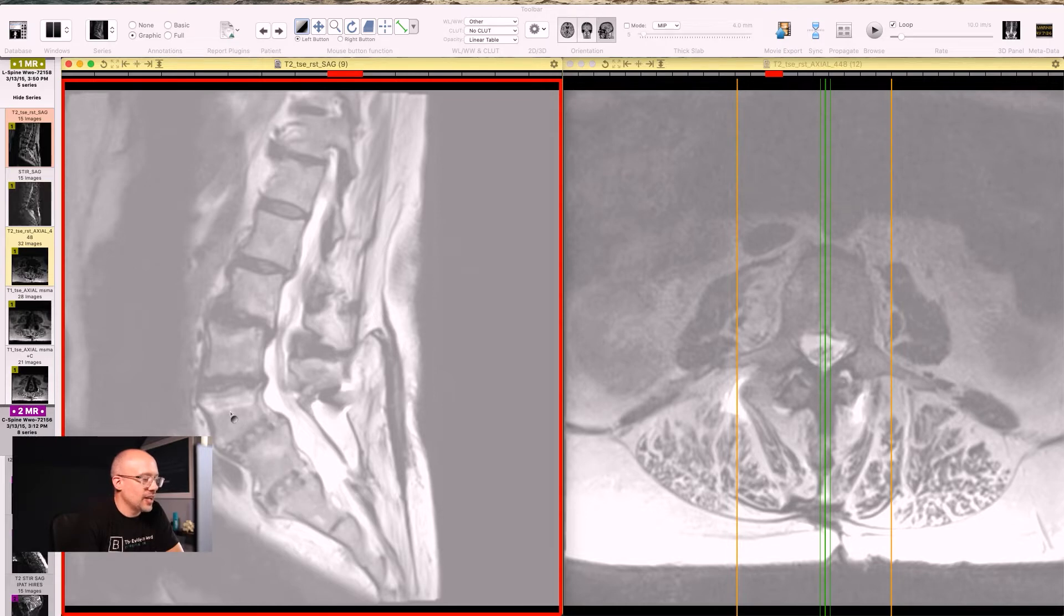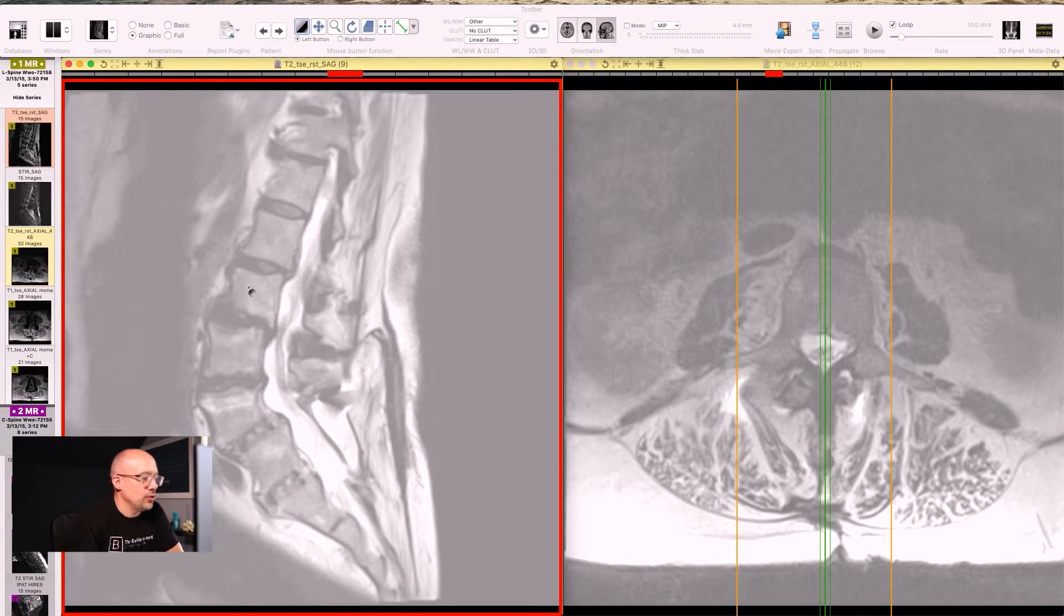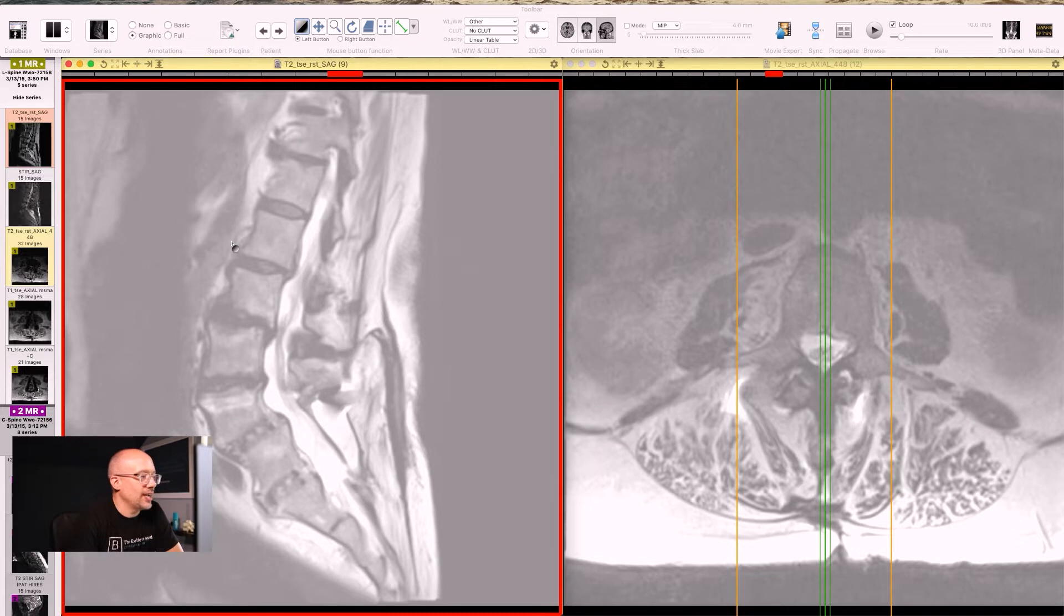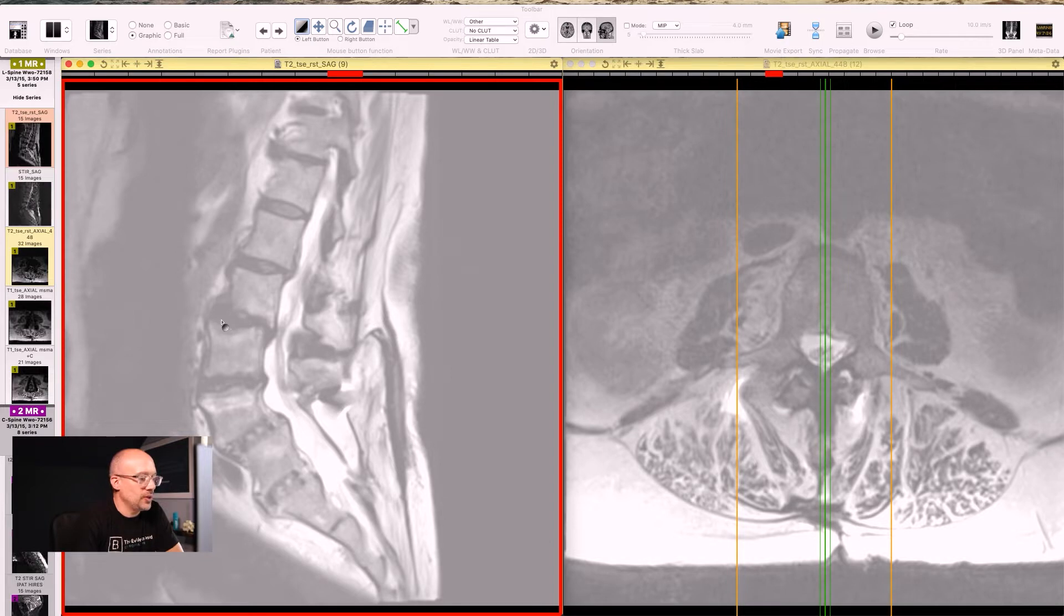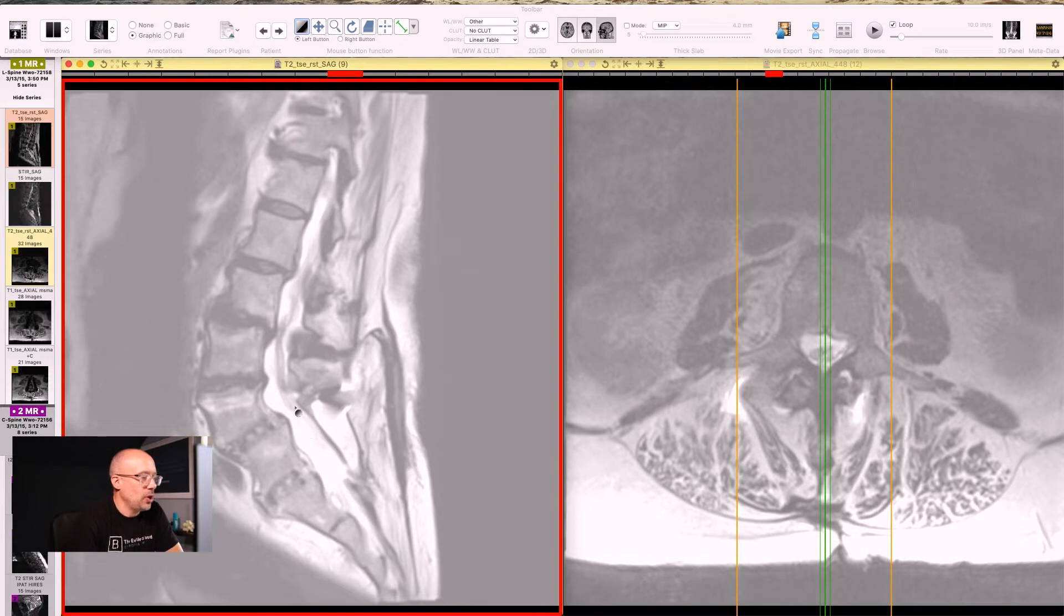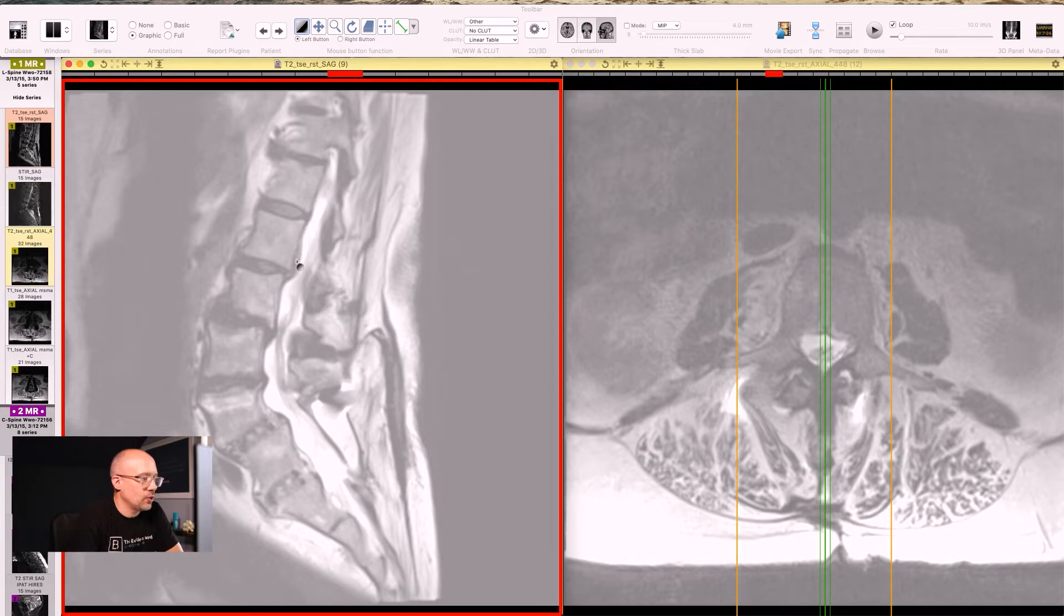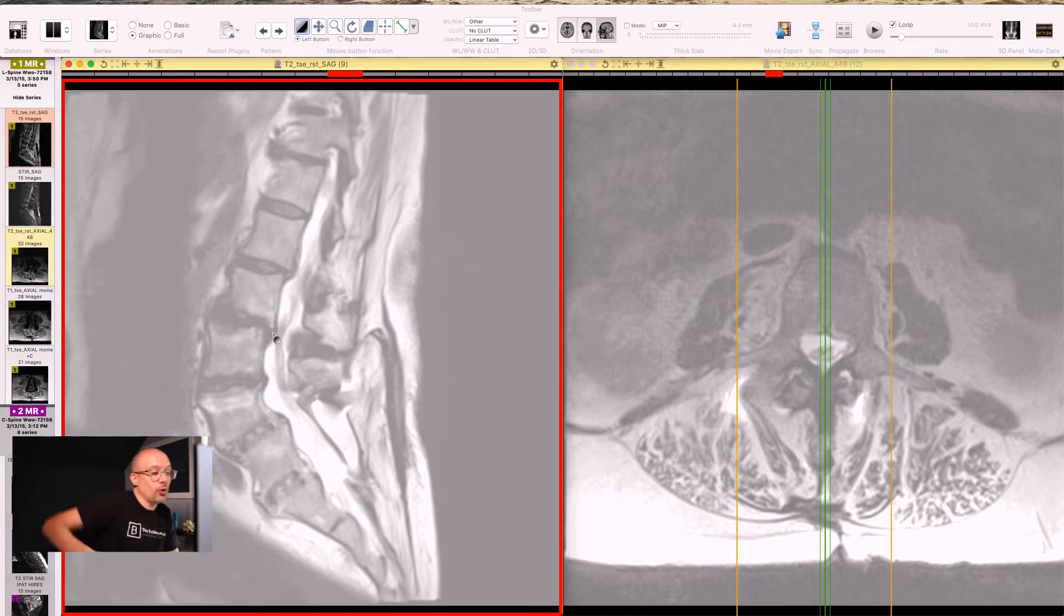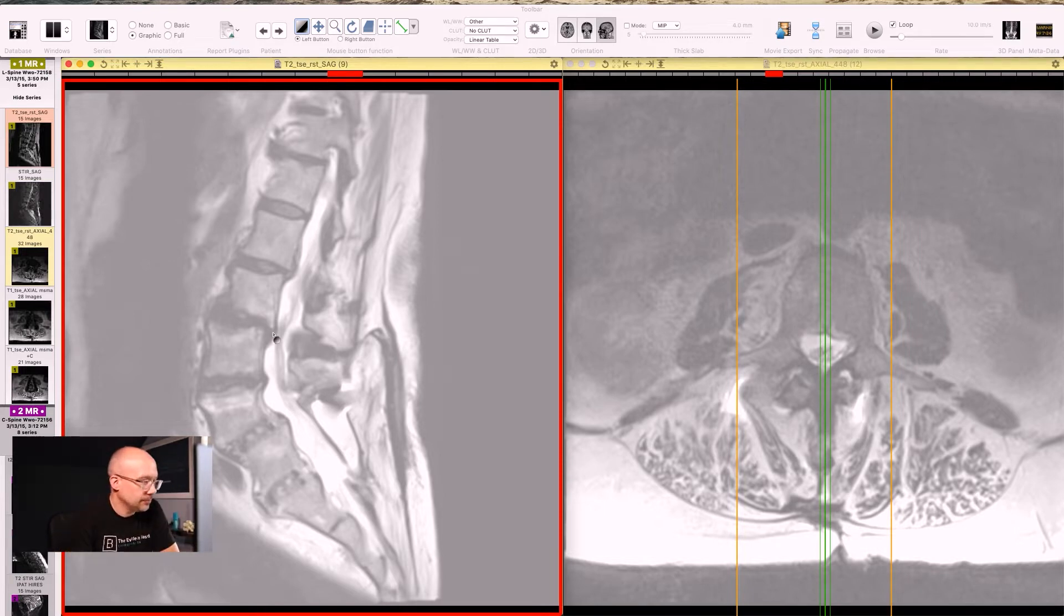Above L5 is L4. I'm circling that right now. L3, L2, and L1. So the big gray squares are the bones. And the discs go in between. The dark material in between those big gray squares or the vertebra are the discs, which they are supposed to be there. That white area going all the way down, if you see me tracing it, all the way down the posterior or backside of the bones and discs, that is the spinal cord or the spinal canal. And it becomes the cauda equina as we get down towards that lower lumbar. We're looking at a lower low back right here.